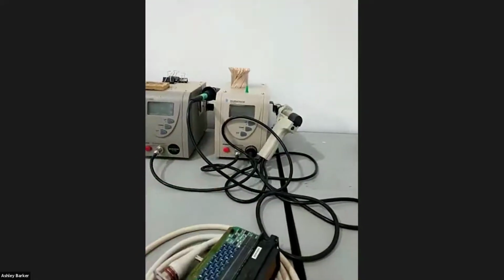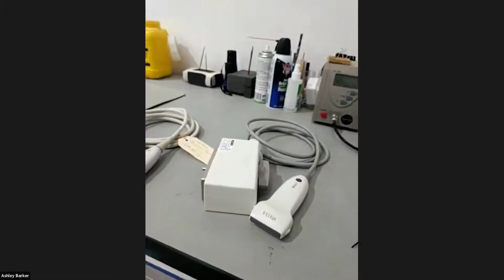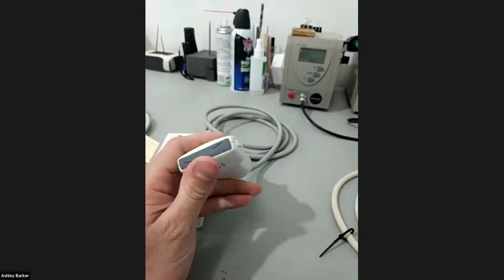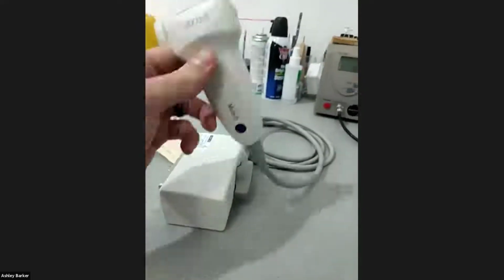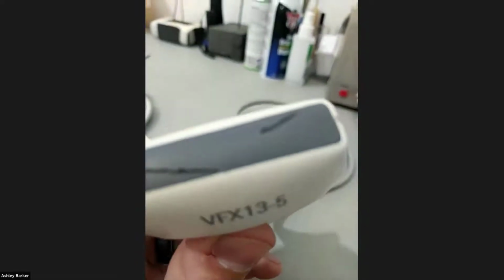Right, so that sort of gives you a bit of a feel for things. So what I want to do now is just run through, I basically just went through some old probes we have and found some very familiar looking damage that I thought I can run you guys through. So this one here, what is this? This is a Siemens probe. And you can see the needle damage on the lens there.